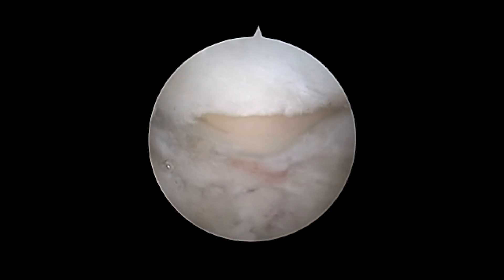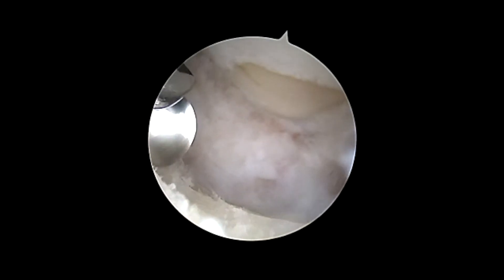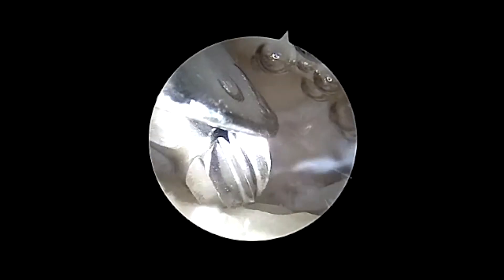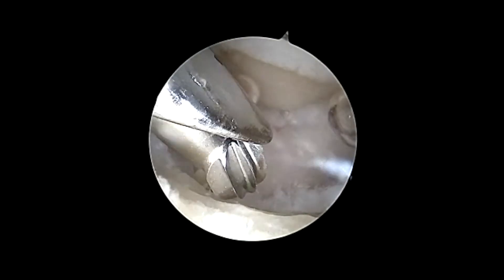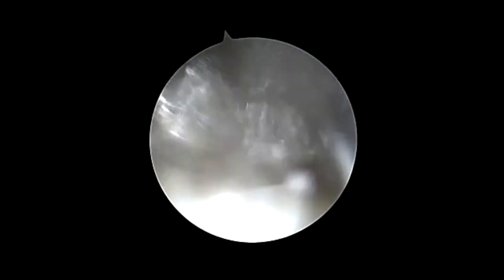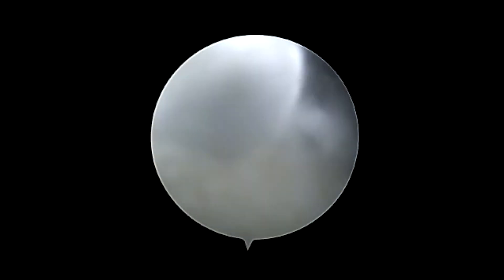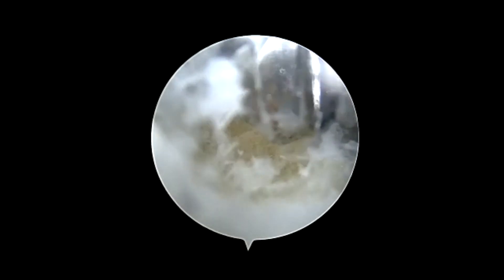Next, an arthroscopic burr is introduced into the CMC joint in order to perform the arthroscopic hemi trapeziectomy. An Arthrex 3.5 mm round burr is used to burr down the surface of the trapezial joint surface, followed by an Arthrex 4.5 mm round burr. Care is taken to protect any remaining native cartilage, and only the surfaces that are denuded of cartilage are burred down during this portion of the procedure.